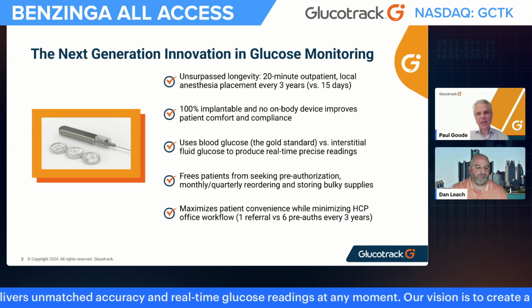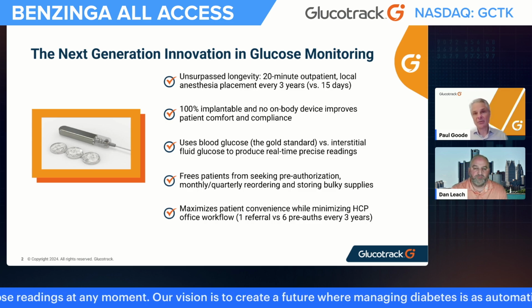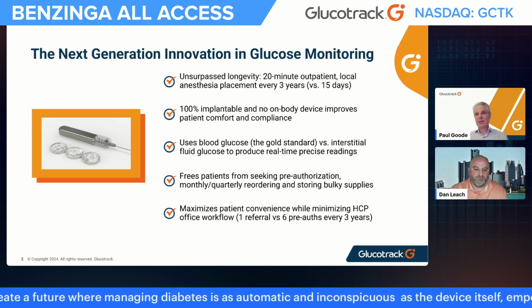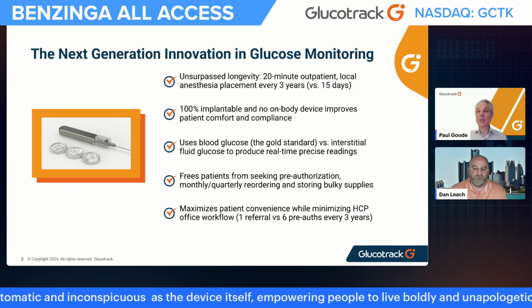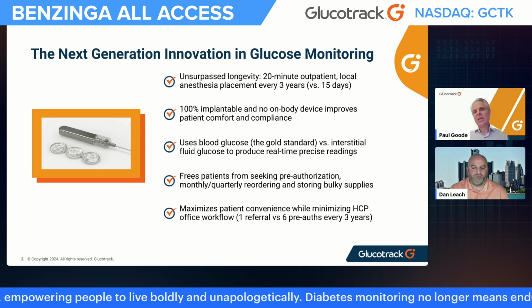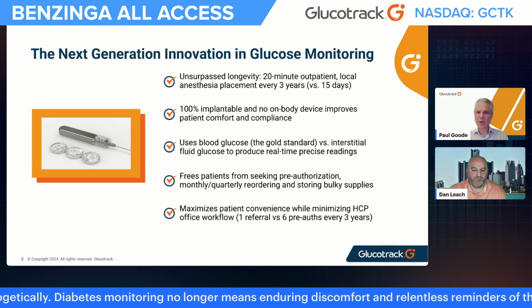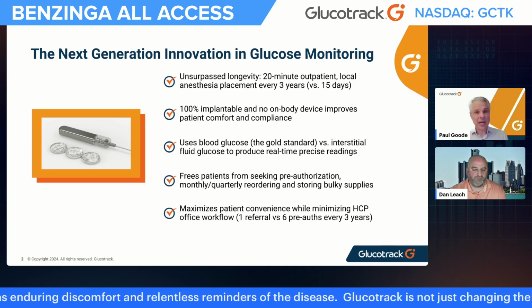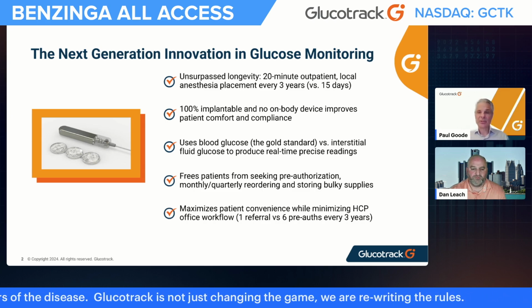And when you want to understand what the reason is, it really boils down to two things: wearability and accuracy. There's a collection of reasons on the wearability front. The adhesive itches the skin. Oh, it hurts going in. Oh, I don't want people to see me wearing this. Or it snags on the furniture. All those types of wearability issues are in aggregate one type of problem. The other type of problem is accuracy. Now, these sensors are indeed very accurate, the typical CGMs, but they do have a time lag from blood glucose, which is about 10 to 15 minutes.